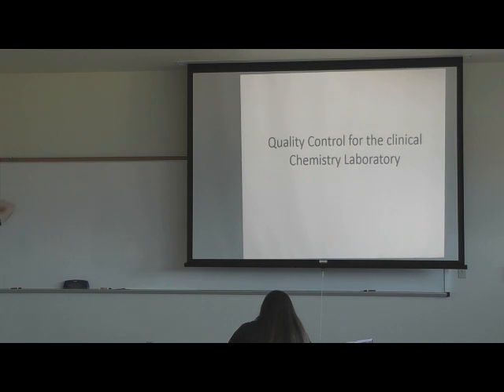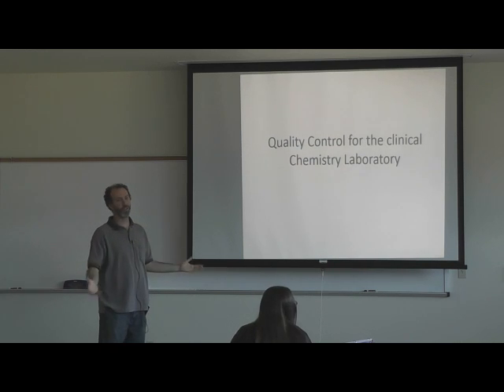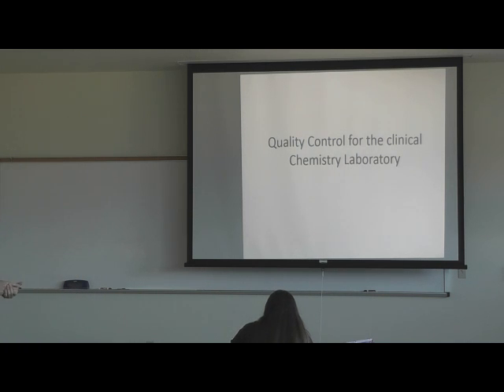You shouldn't even have pictures there. But she doesn't know how to read those graphs, and I bet you don't either, or maybe you do. But your book does a terrible job at covering them. This is mine. Okay. So we're going to talk about quality control in the clinical chemistry laboratory. What's the purpose of quality control? So you monitor to check everything is in order? Yeah, you want to monitor, make sure your equipment and your lab is running properly so you get the proper values for patients' samples, right?